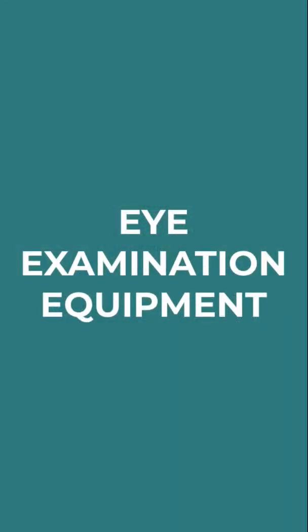Hey guys, welcome to the second episode of iTeach. I had somebody ask me a really good question in regards to what each piece of equipment does when you come in for an eye exam. So I thought we'd take a couple of minutes to go through the function of each machine.